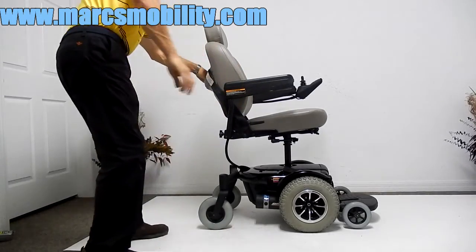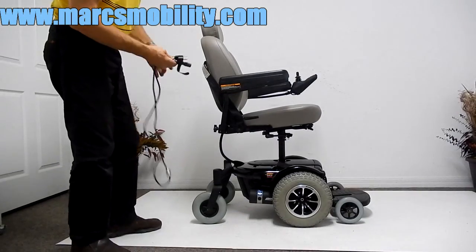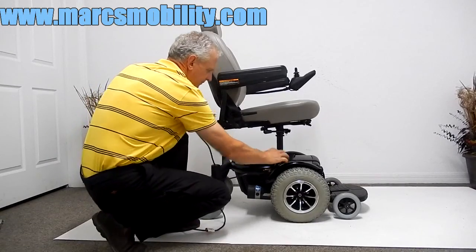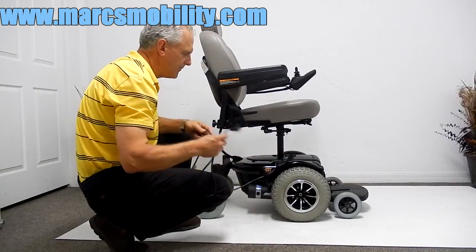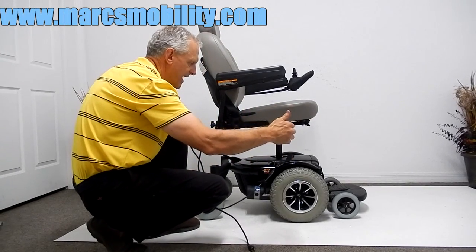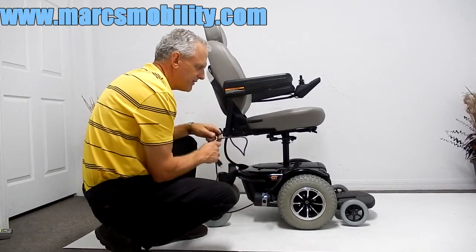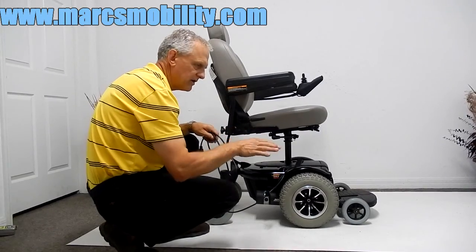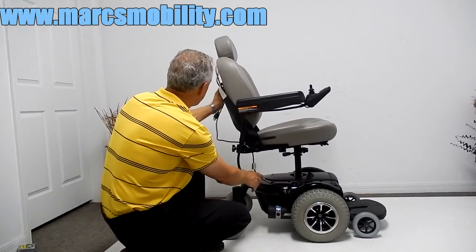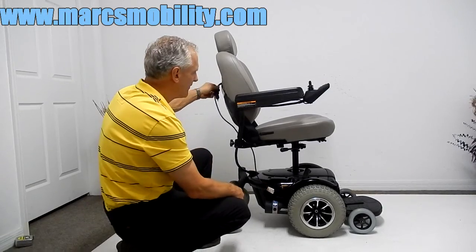If you need to charge this chair, you usually have a cord in the back pouch. Take your cord — this chair has a built-in charger right here. Plug the cord into the side of the charger, plug it into the wall, and once the ammeter goes back to zero — it will move 2, 4, 6, 8 depending on how your batteries are doing — it will move back towards zero and it's full. You don't have to worry about the charger stopping; once the batteries are full, the charger will turn off automatically. We often leave the cord in the back pouch so you don't have to plug into the chair every time — just pull it from the back pouch when needed.